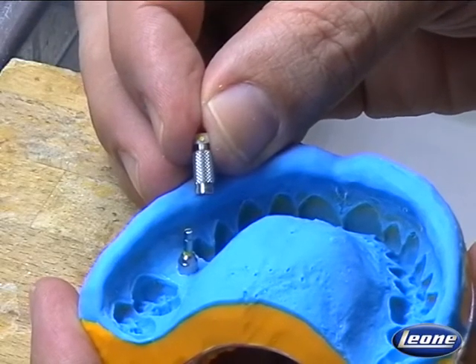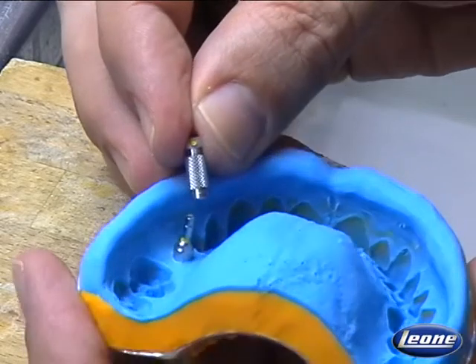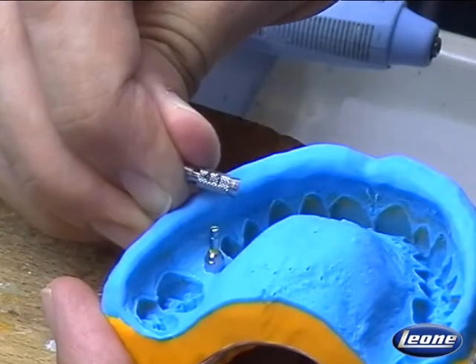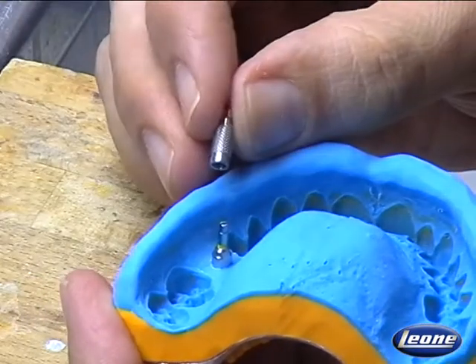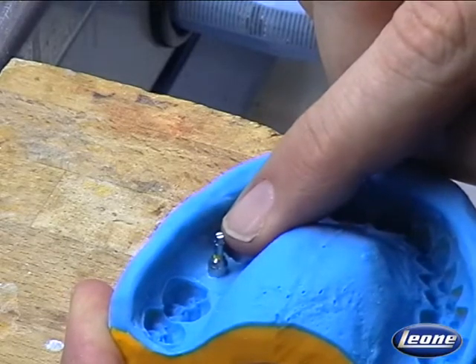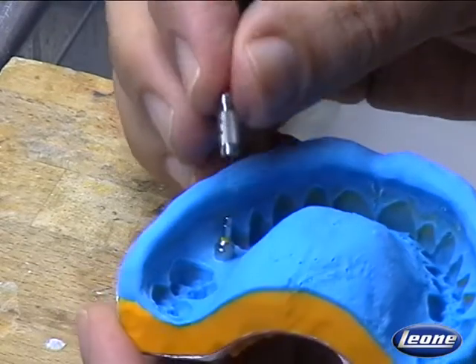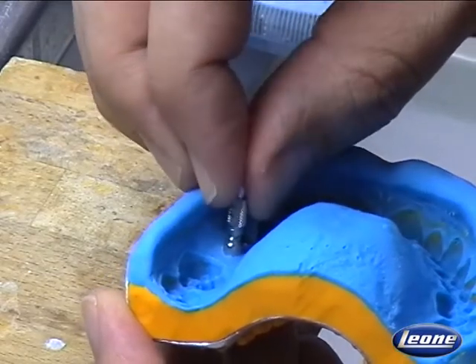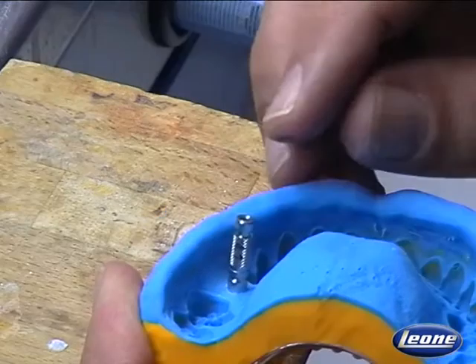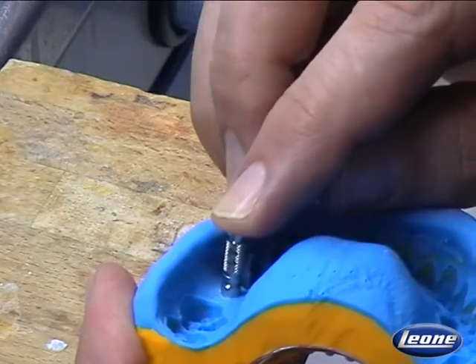prosthetic restoration. We check that the analog and transfer are the same color code and have the same diameter, laser marked, and then we connect the analog to the transfer, thanks to the split hexagon. I rotate in order to find the engagement of the hexagon, and then I push the analog all the way down, exerting a pressure on it to be sure that it is properly connected.